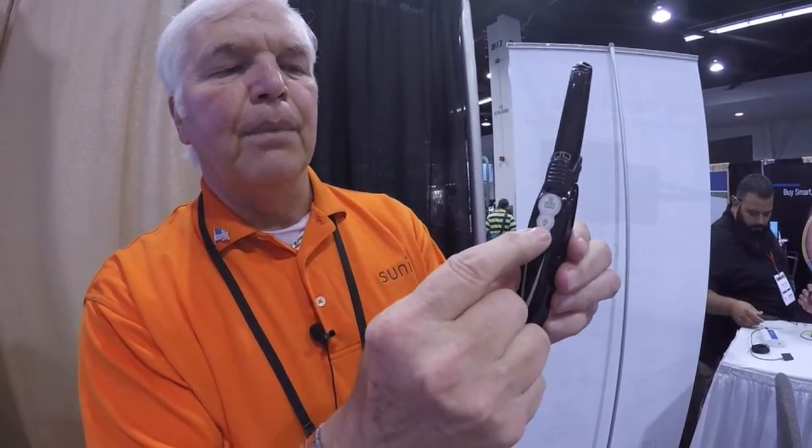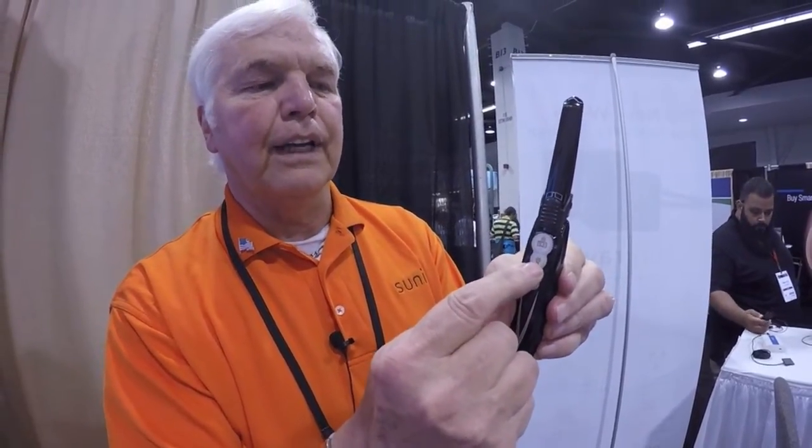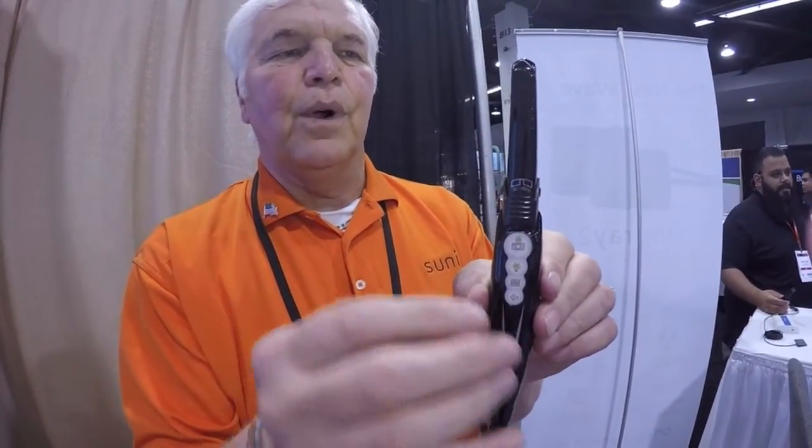You also have a mode here that's kind of neat. It uses grayscale. So if I hit that, it will give your image in grayscale if you're doing shade matching like for the lab. It will also do the cavity detection, caries detection, where it illuminates the tooth through transillumination. So as you go inside the mouth, it will illuminate the tooth, and you can actually see through it to pick up any kind of decay. So that's kind of a nice little feature.